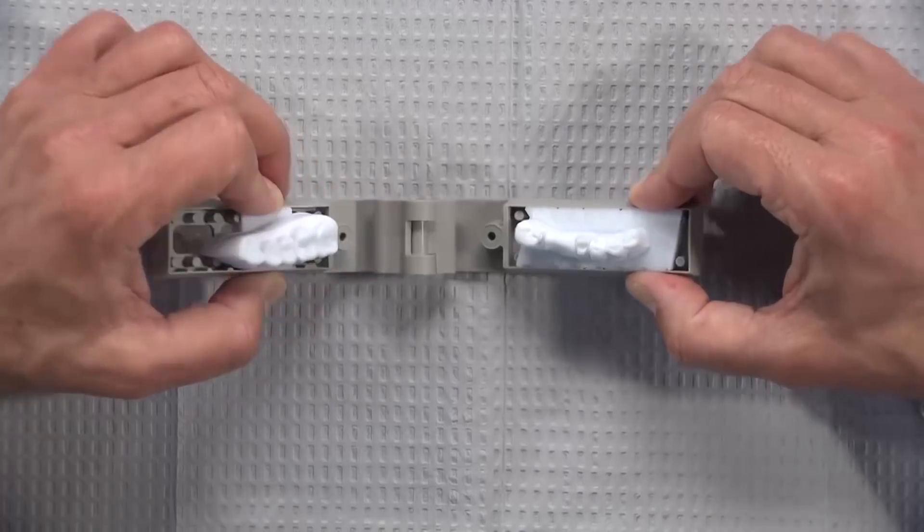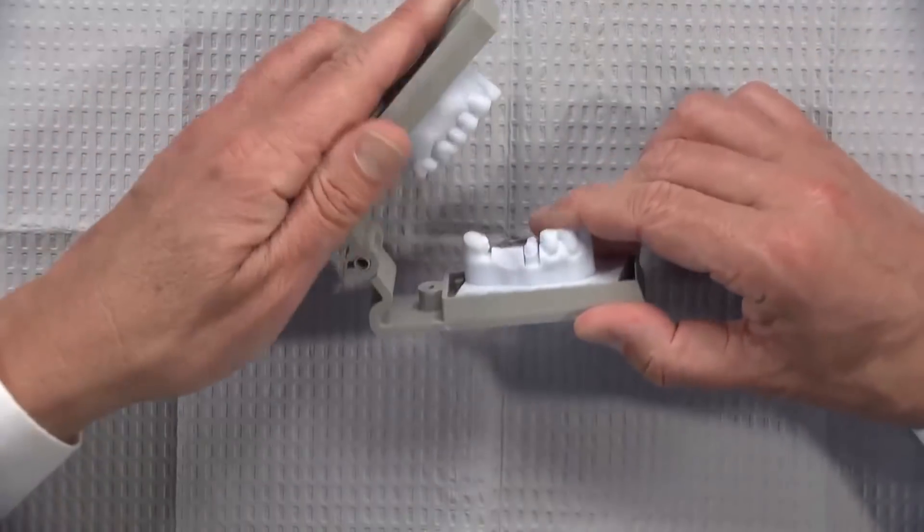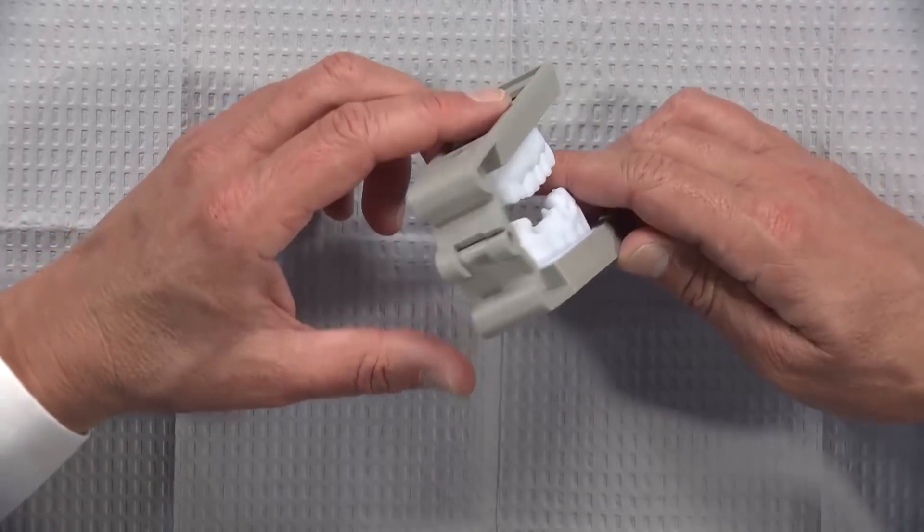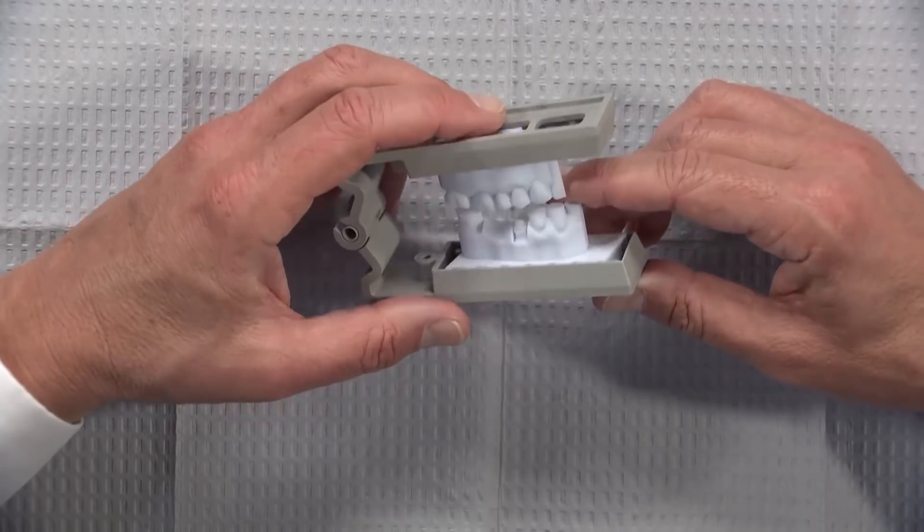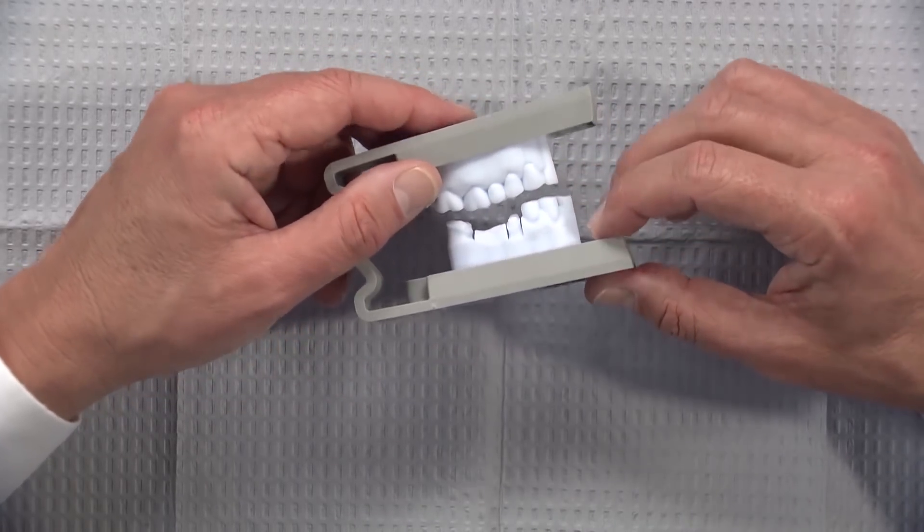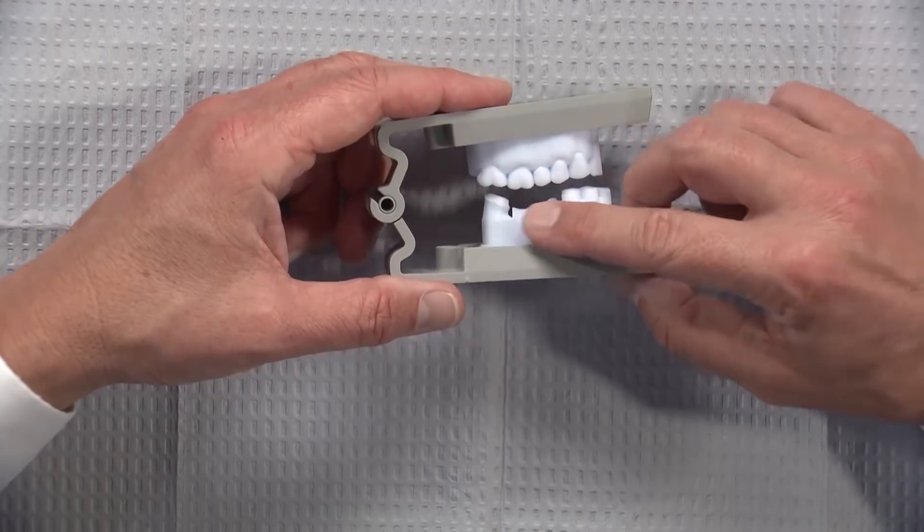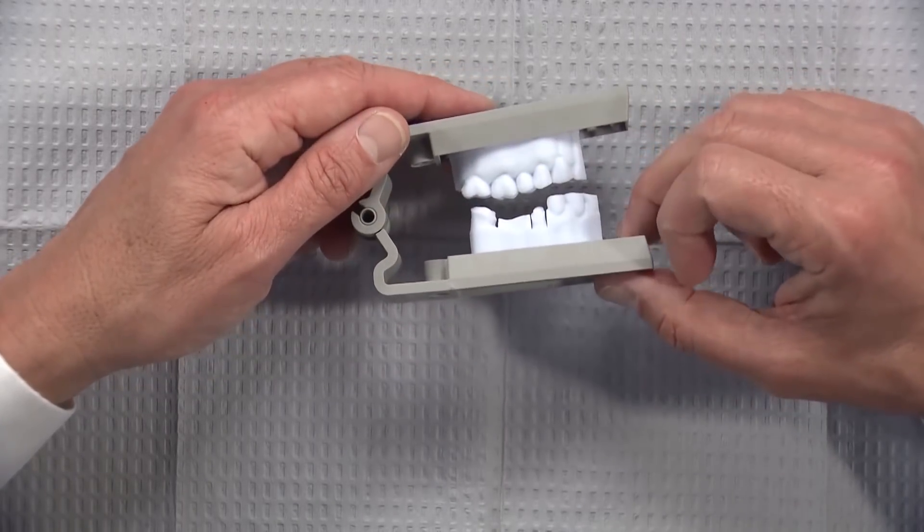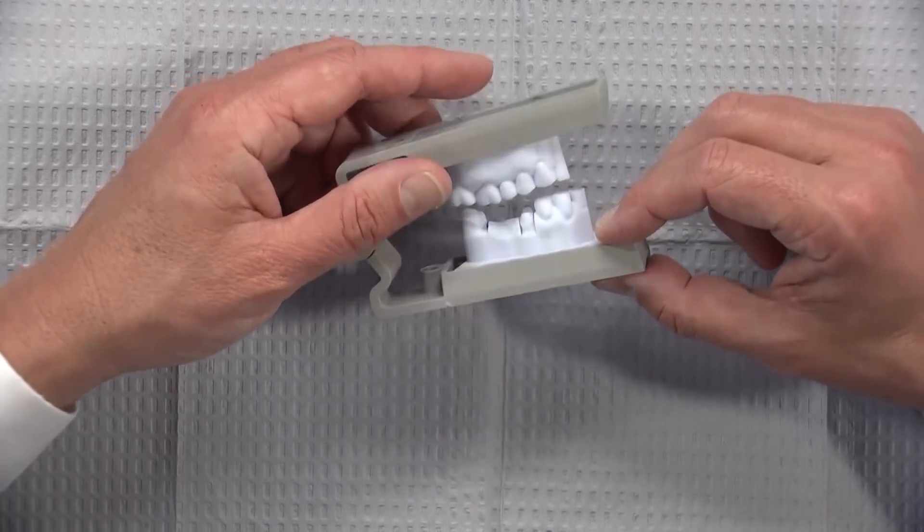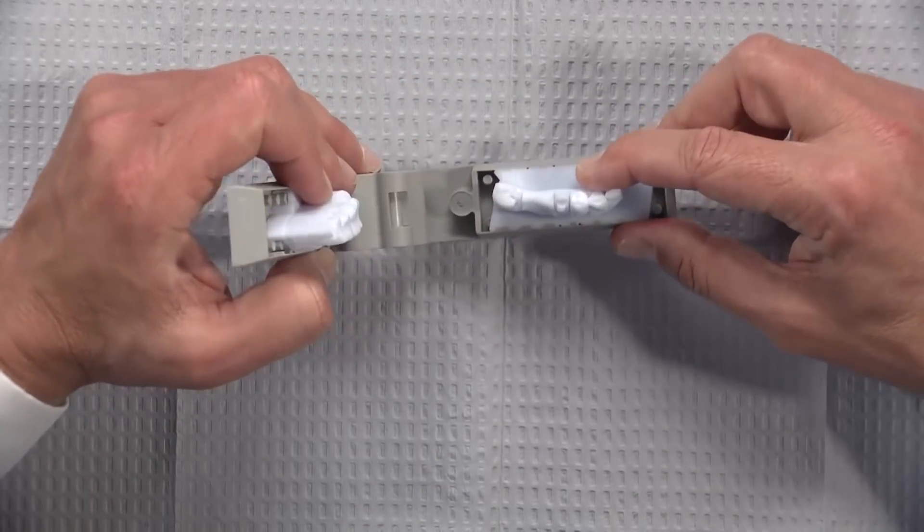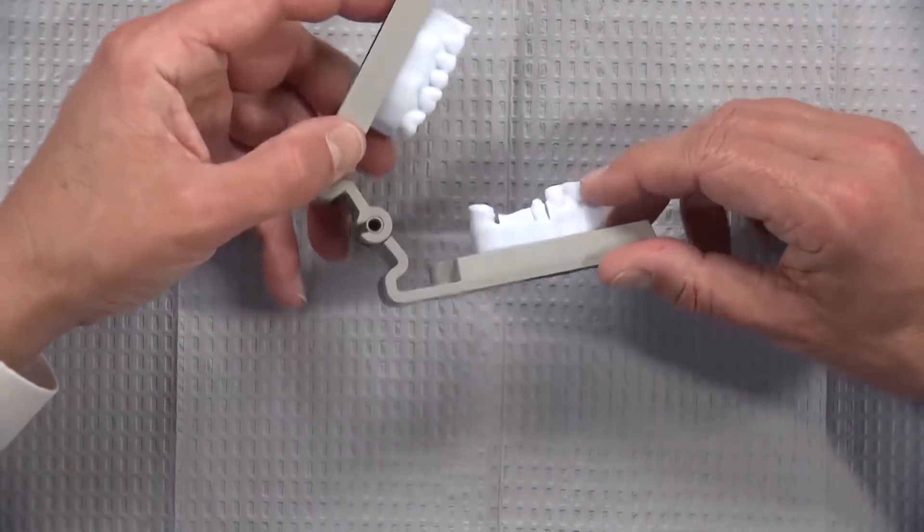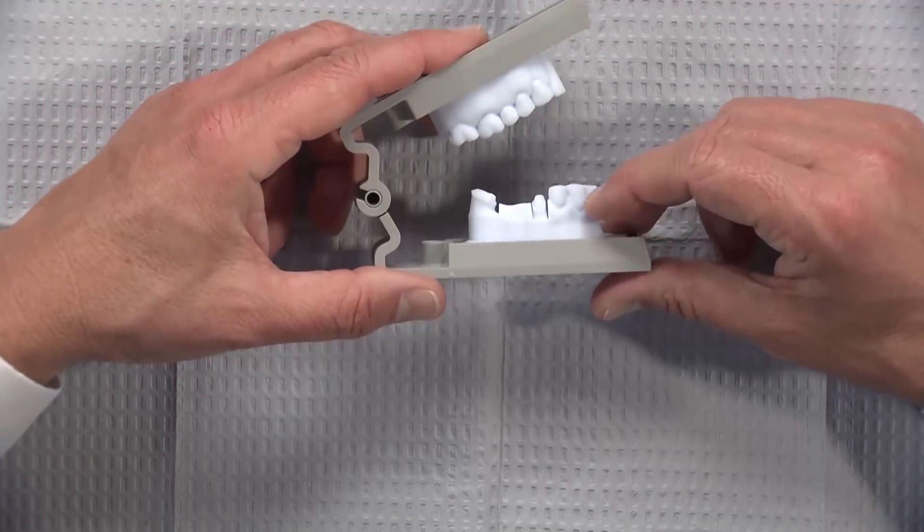This is what a 3D printed model looks like and it comes with their articulator. All in all it works very well. There's a different level of resolution and accuracy done on the prep side versus the opposing side just in terms of speed and efficiency, but we're able to work with these models well.